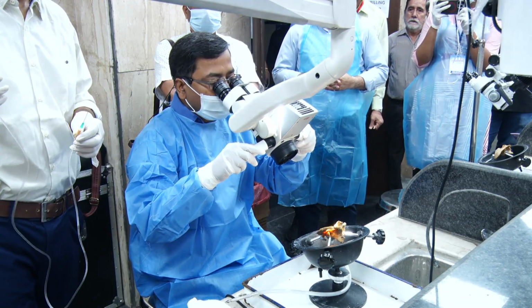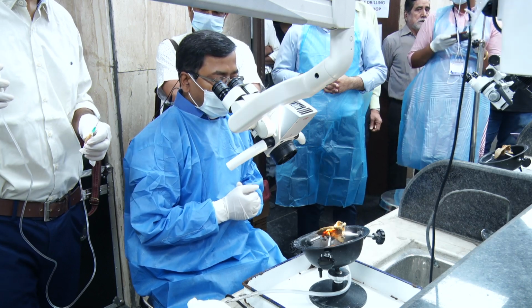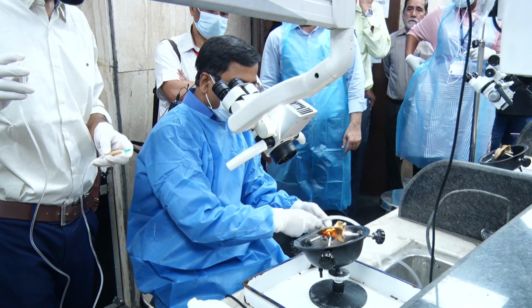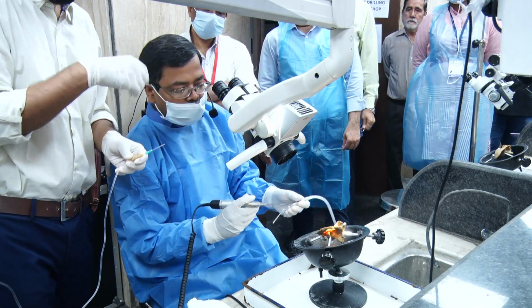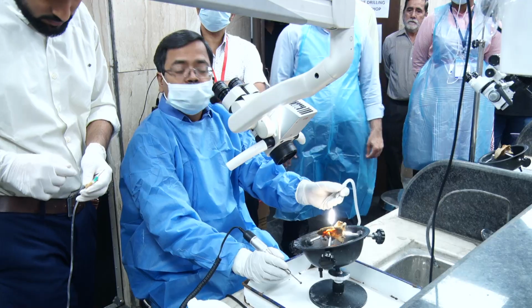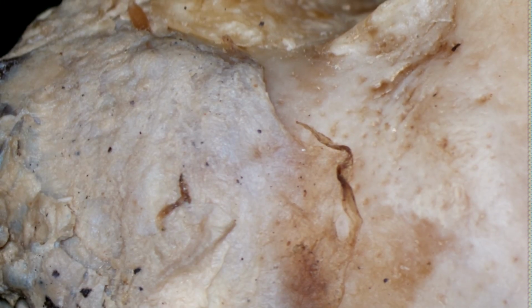Okay, so for the cortical mastoidectomy, we need to start drilling at the cribriform area, right? So the cribriform area is basically located in the area of the mastoid. So you just find the external auditory canal. So this is the external auditory canal, you can see. Okay. So this is the posterior canal wall, and this is the zygoma, right?